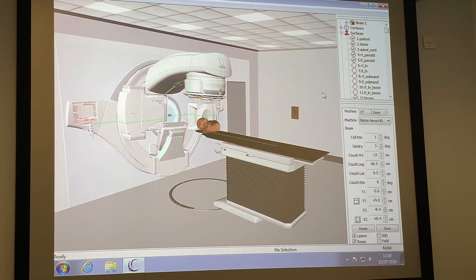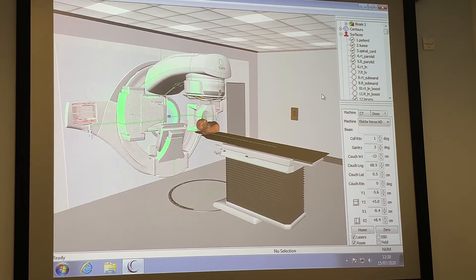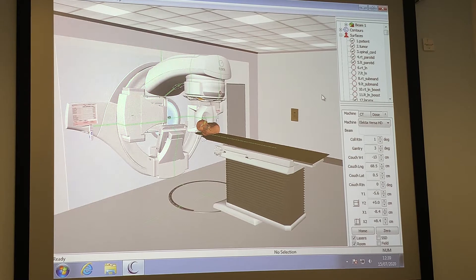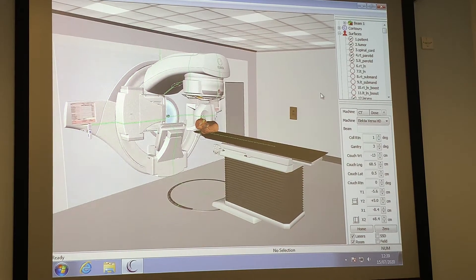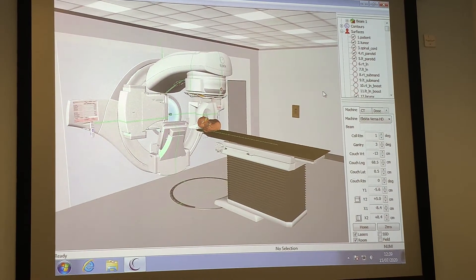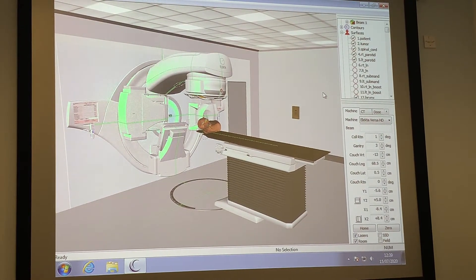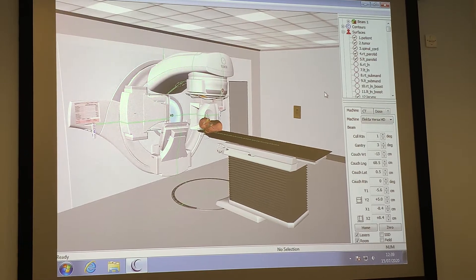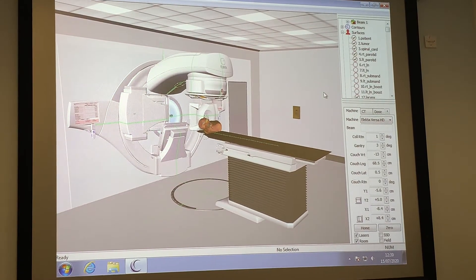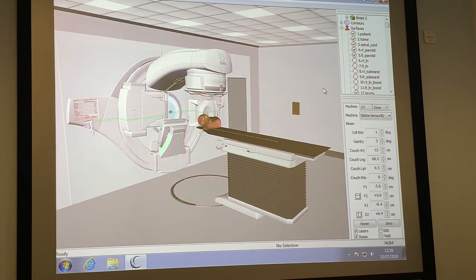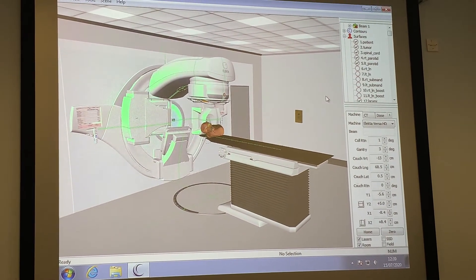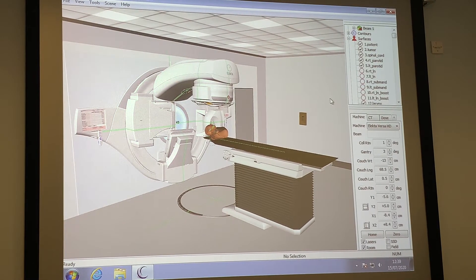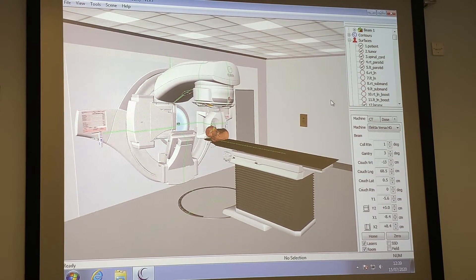The Leeds Cancer Centre has 12 linear accelerators and it's a regional centre serving a Yorkshire population of about 2.5 million. The centres are busy, treating around 40 patients a day, give or take, and it's an outpatient treatment obviously.